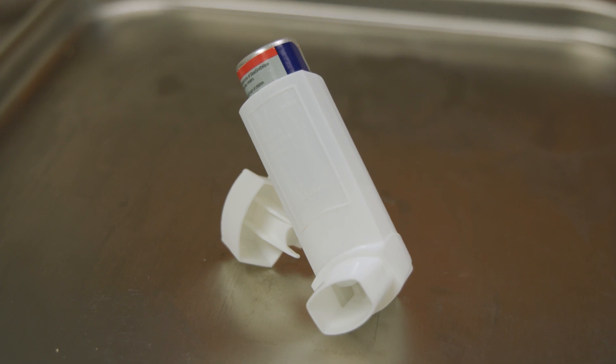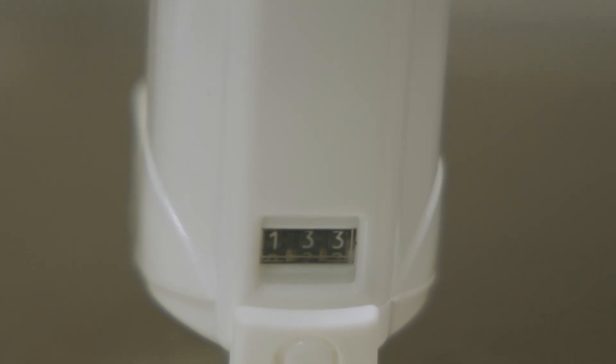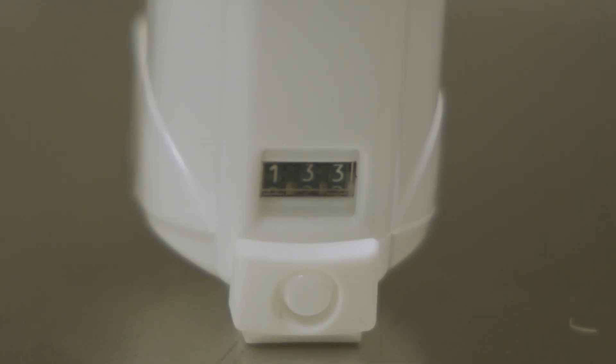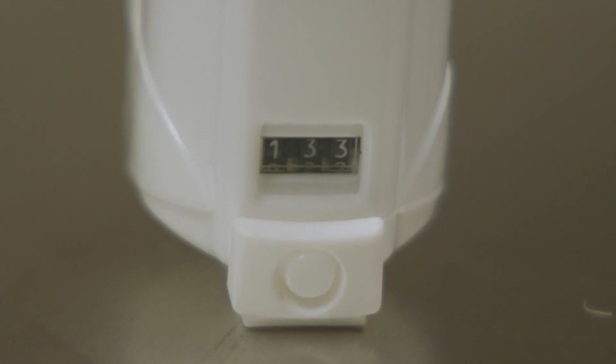Inhalers can also have different amounts of medication inside, so to make it simple to keep track of how much is left, a counter can be found on the back of the inhaler. Please pay close attention to the counter and refill through your pharmacy or physician, making sure you have at least a three-day supply between refills.